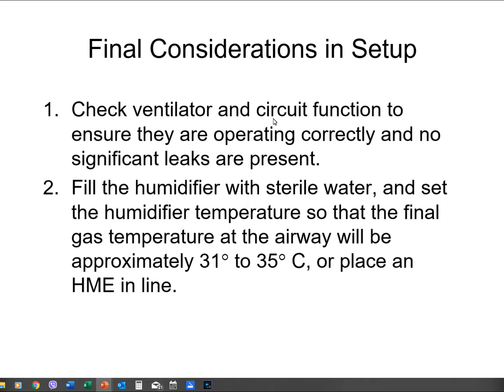Honestly, you want to, number one, check circuit function. You have the SSTs, that's what we do, and ESTs. And I know I didn't do that for us in lab because with the PB840s, if I do an EST, it needs some kind of golden tubing, and it messed up our ventilator, I think, the first term that I taught. So I don't want to mess with that.